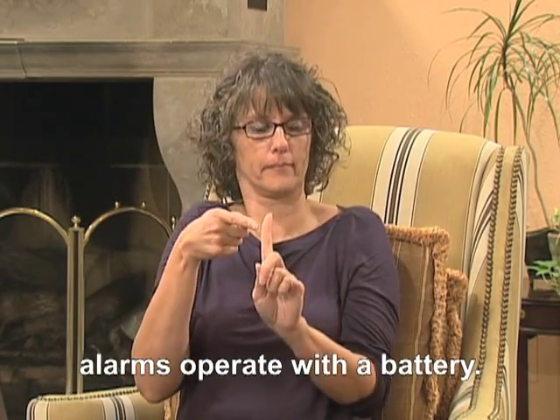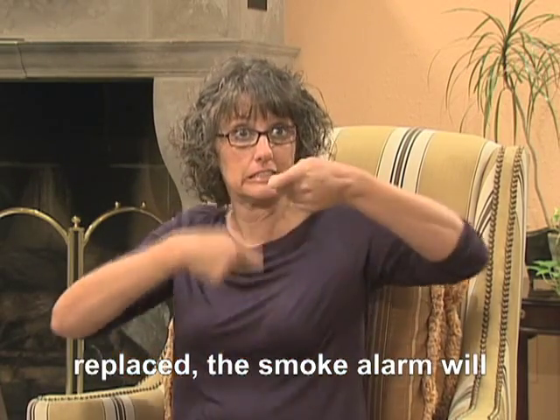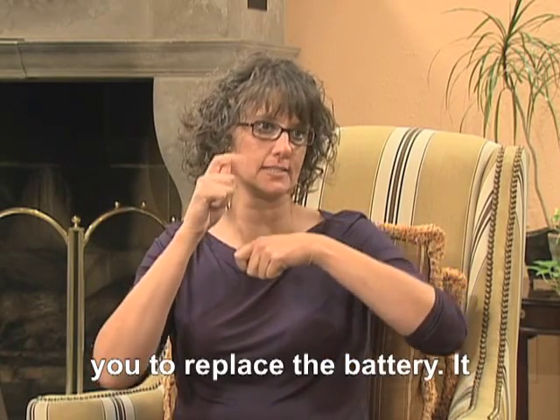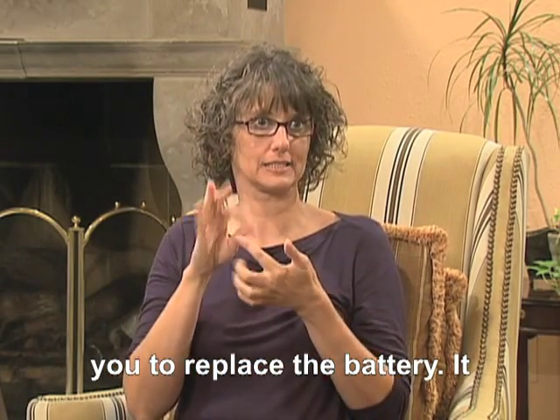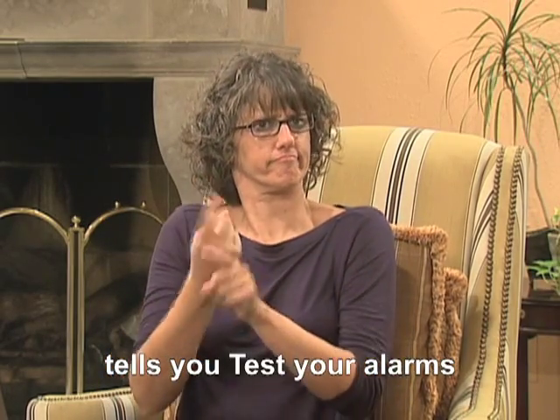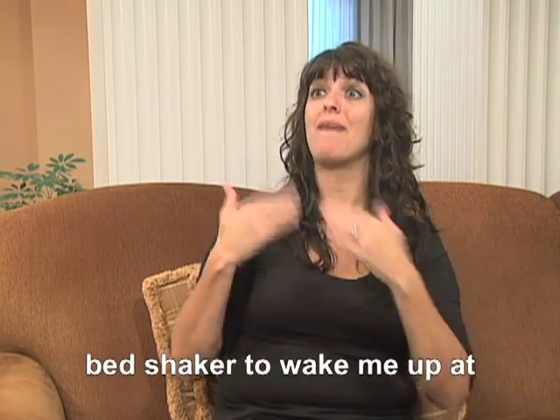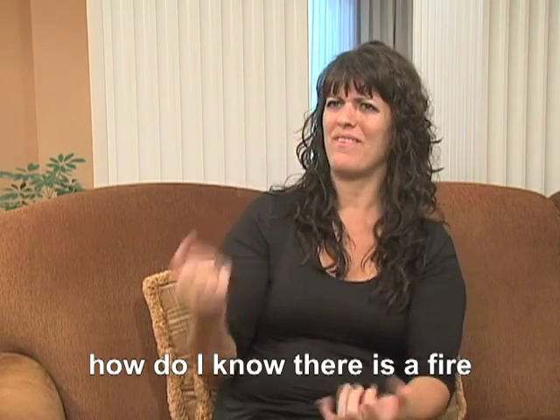Some smoke alarms operate with a battery. If the battery needs to be replaced, the smoke alarm will chirp. But we can't hear that, of course. The chirping is telling you to replace the battery. It will continue for seven days. You won't know that the battery is low unless a hearing person tells you. Test your alarms regularly so you know they are working. So the smoke alarm battery may need to be replaced — I can do that myself. I have the bed shaker to wake me up at night if there's a fire. But how do I know there is a fire when I am not in my bed?